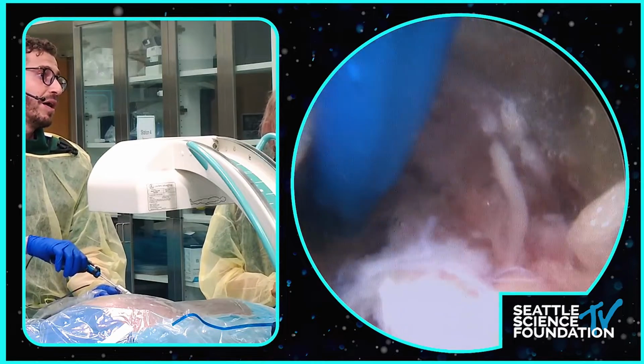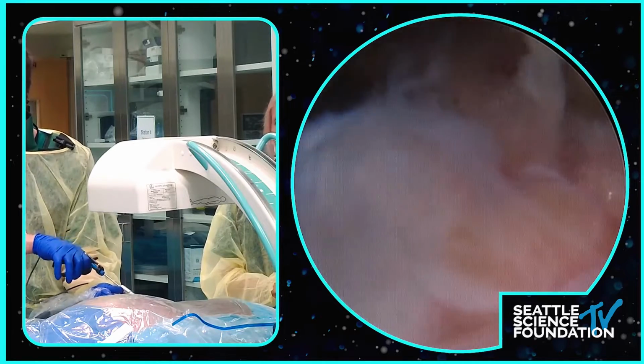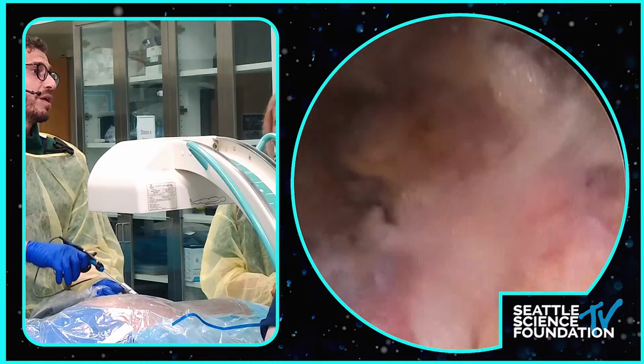What's the first thing that you look for when you put the scope in? For me, I look for the pedicle and the SAP junction. What about you all? Exact same thing. And usually the reaming is a nice way to know, okay, I've been here before. This is where I was.